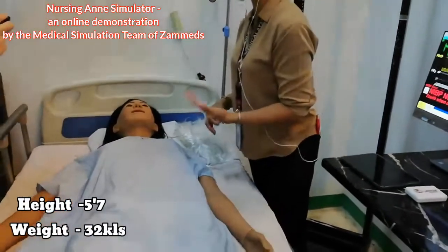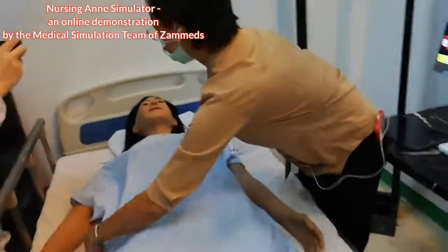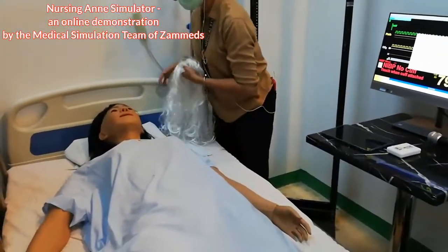The weight of our nursing aunt is 32 kilos only, so she is easy to transport. And then I'll walk you through from head to toe.